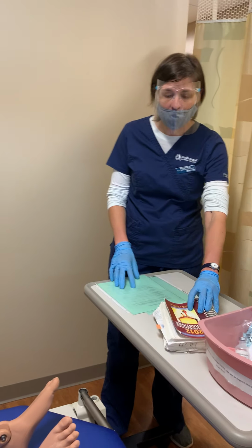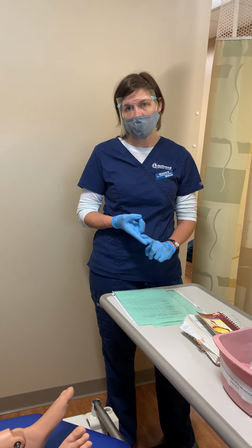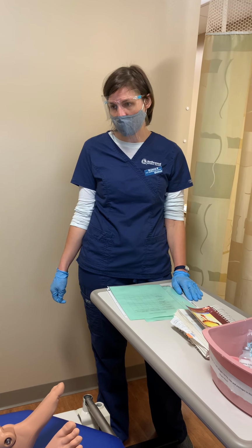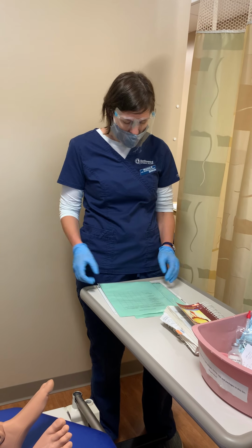I've looked at my drug reference book. My normal saline is compatible with both the morphine and with the potassium chloride, and conveniently the potassium chloride and the morphine are also compatible. However, I will be administering those in separate lumens anyway.